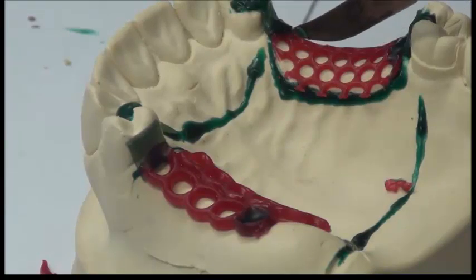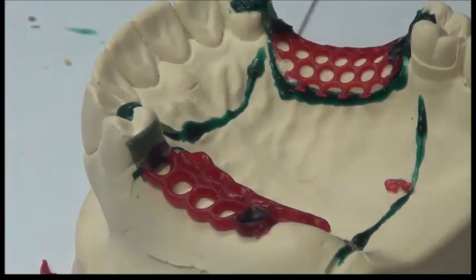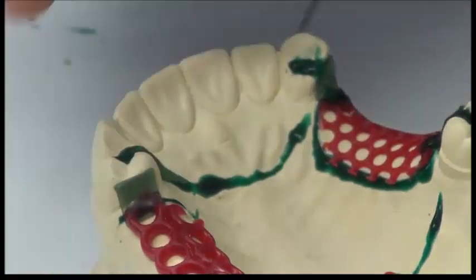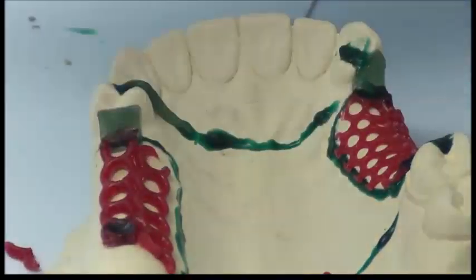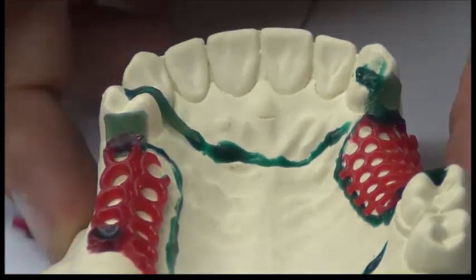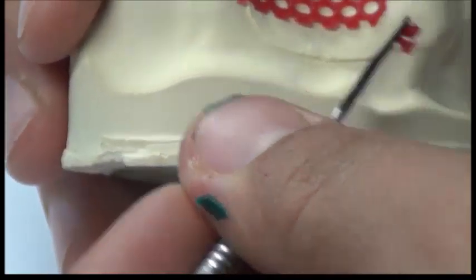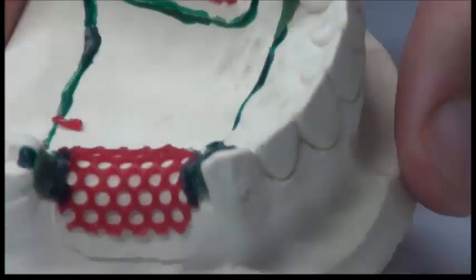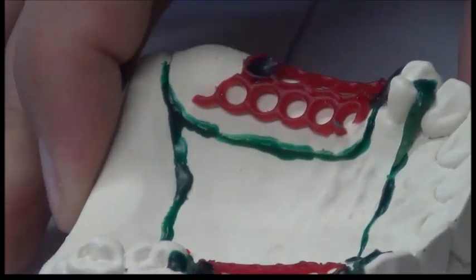Over it we were going to place another thing called external finish lines. We're going to tell you about them in a moment. And we're also making them round from the buccal surface. And we're going to repeat the same procedure for the lower in a moment, okay?